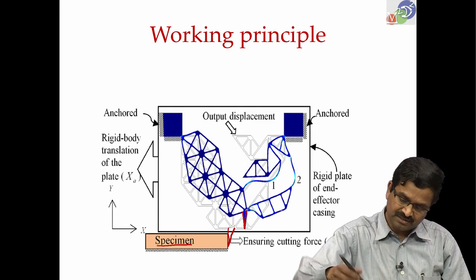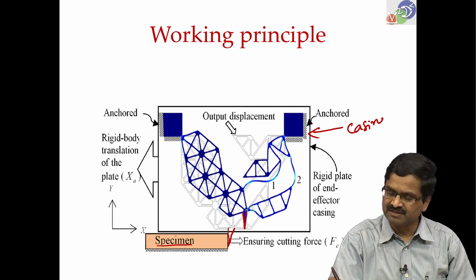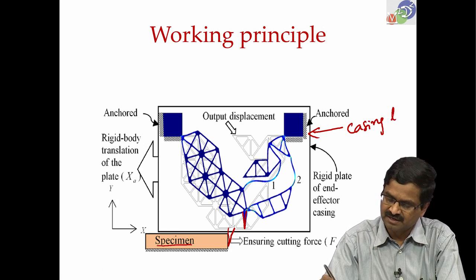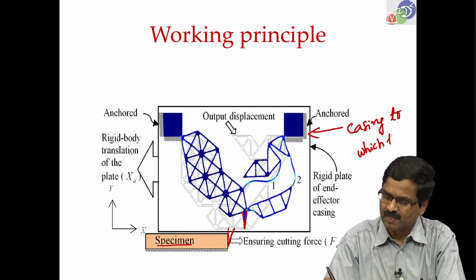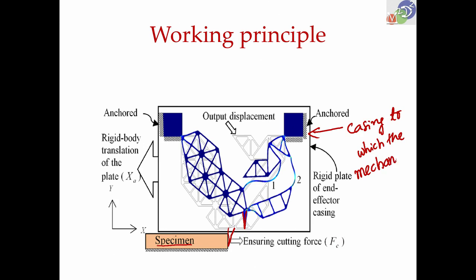Since we are still moving this casing, the casing to which the mechanism is attached, it keeps going, but then this is retracting.